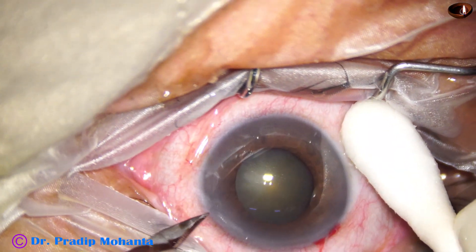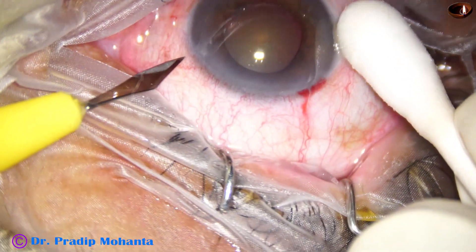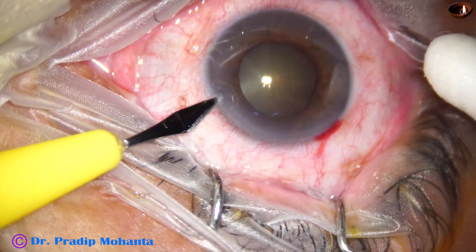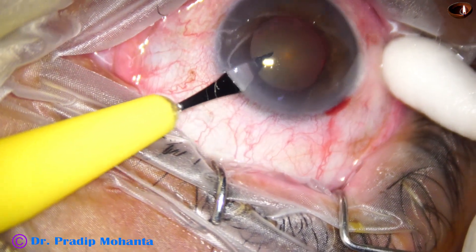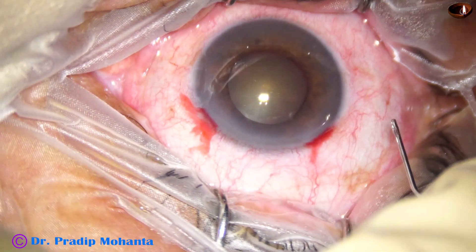The main incision has been done. This is a side port on the left side of the main incision. The patient is under topical anesthesia and the patient is not much cooperative. Side port has been done.